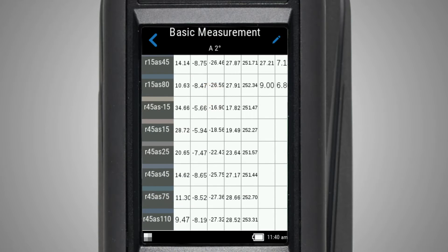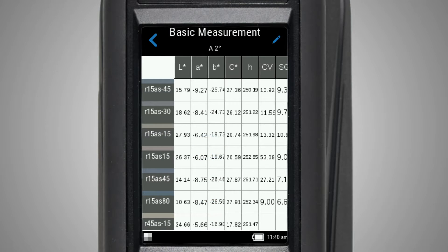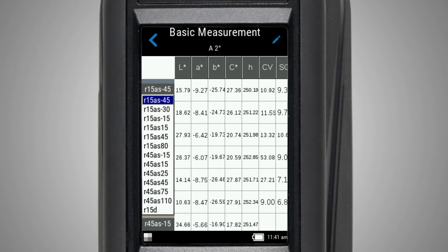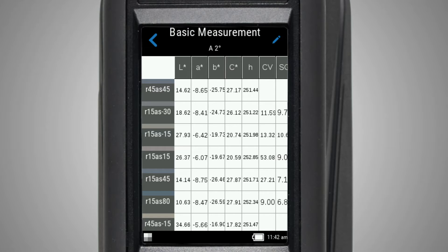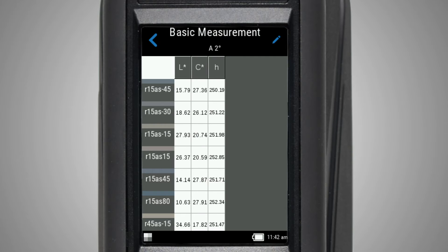You can swipe up, down, left, or right to view all of your measurement data. Tapping on an angle heading will allow you to change the angle displayed for a particular row. Tap the edit icon to access which functions are displayed. For example, we can change the results to show LCH only.